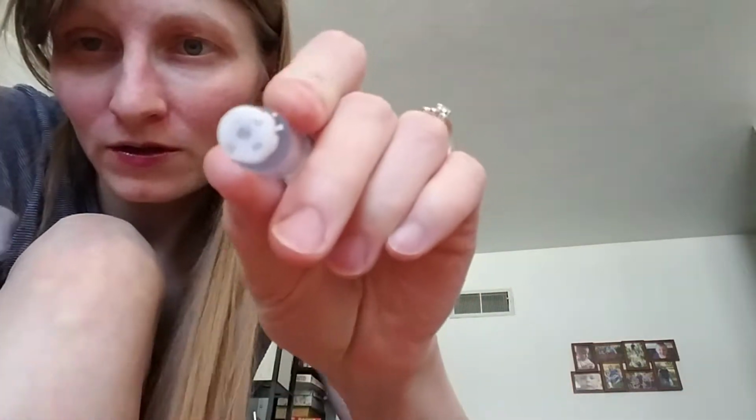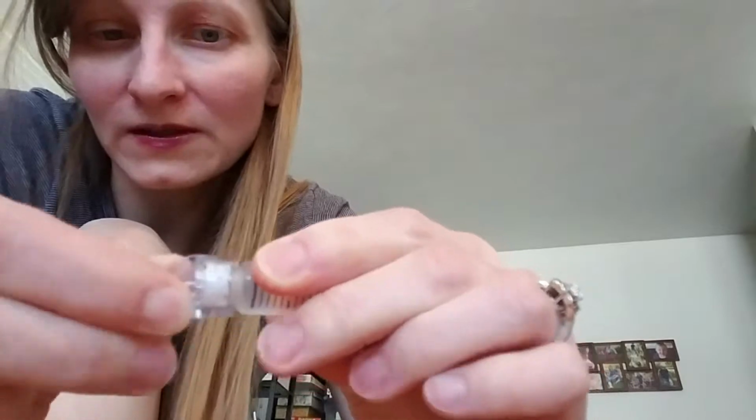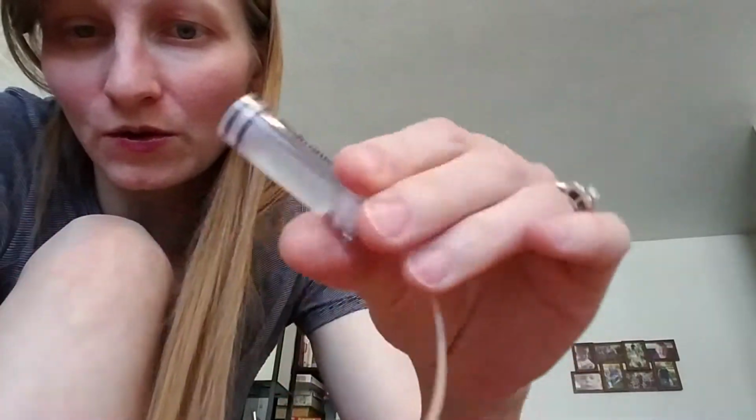There's a little needle in there. I don't know if you can see it very well on that. That's gonna go to the top of that in that little circle there. See that? Okay, so I push it in there and then twist to hold it. Okay, so there's that. But now I need to prime the tubing because there is air all the way through that. There's about 15 units worth of air.